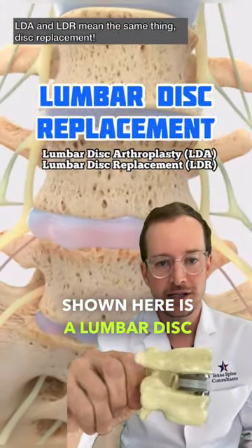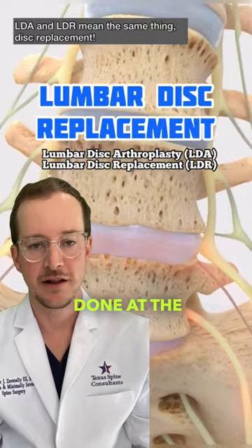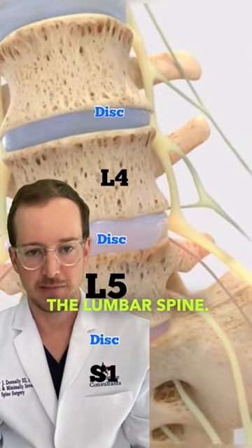Shown here is a lumbar disc replacement. It's mostly done at the L5-S1 area in the lumbar spine.